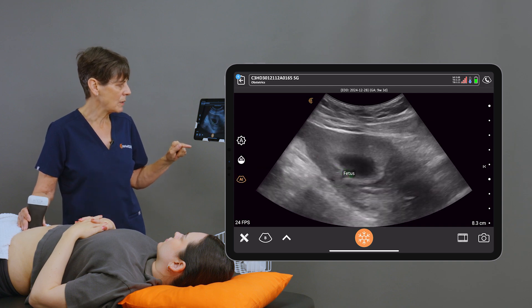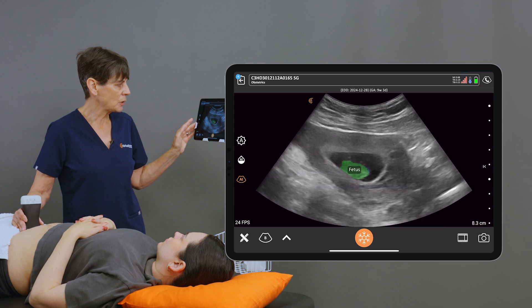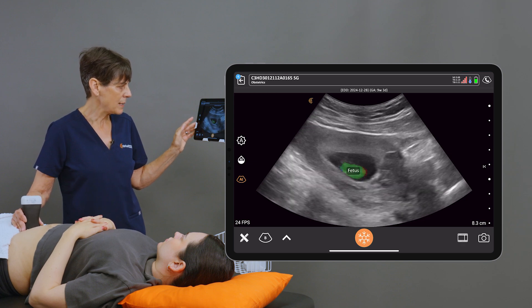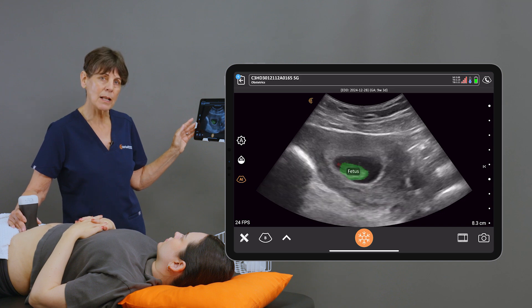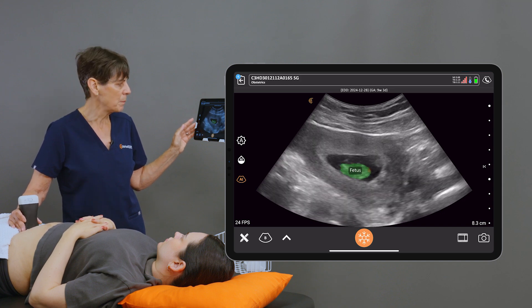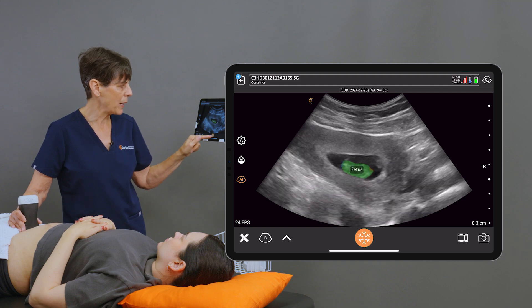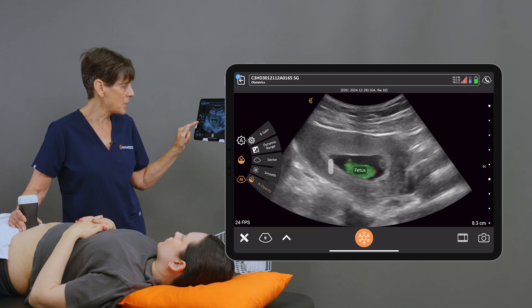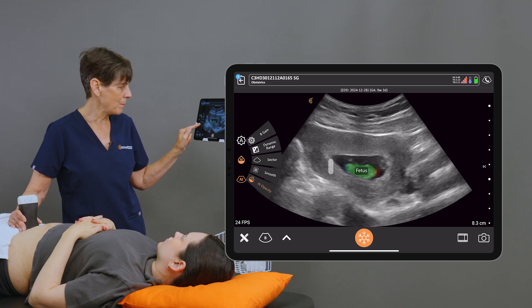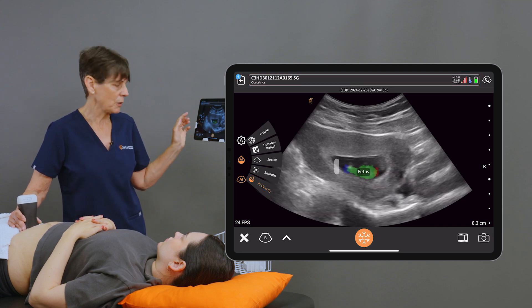Right away we'll see an overlay over the fetus, and the other thing that you'll notice is that there's a red end and a blue end, and this is telling the AI where it needs to place the caliper. It's important to make sure that you have the red end which is identifying the crown and the blue end which is identifying the rump. You can also adjust the opacity of the overlay by sliding from right to left until you get the image that you like.